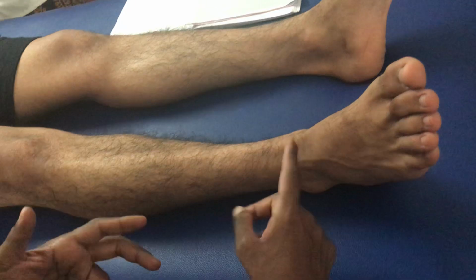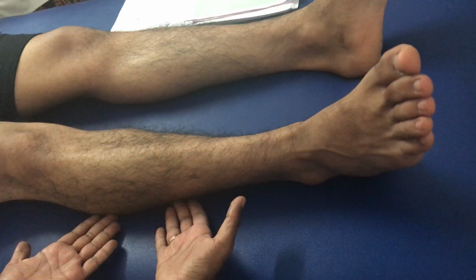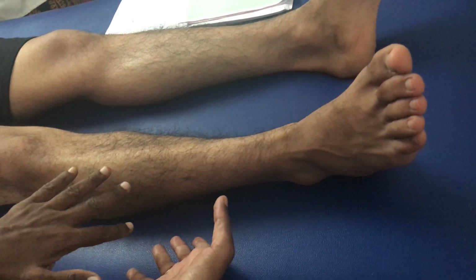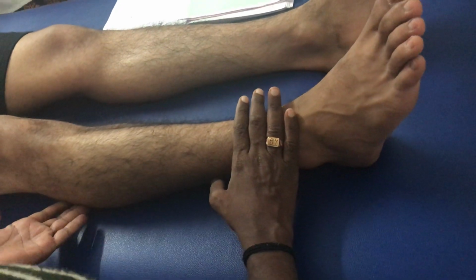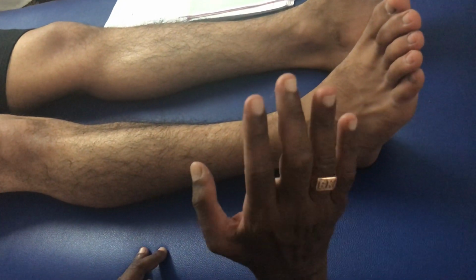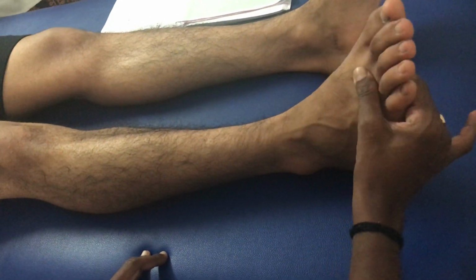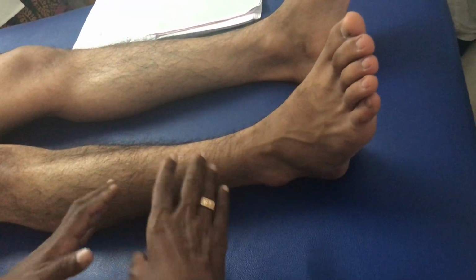And the third most important thing is, sometimes in a denervated muscle, when the other muscles which are good, say for example in this case calf, if he is having a foot drop, the current can travel to the normal muscle. Okay, because it is traveling through the extracellular fluids, so it can reach the calf easily, and calf, since it's good, requires less intensity to get stimulated, so it will start to stimulate. And if you don't palpate, then what will happen is, actually you will be working with your calf that is working, but you are getting to see the rebound phenomena. Okay, so you will be still thinking that the tibialis anterior is working. So that's the very reason I don't want that.